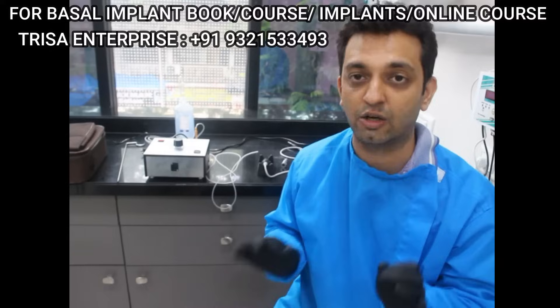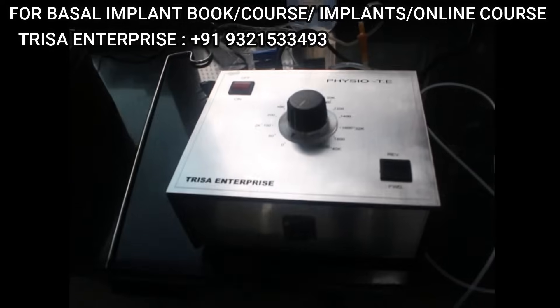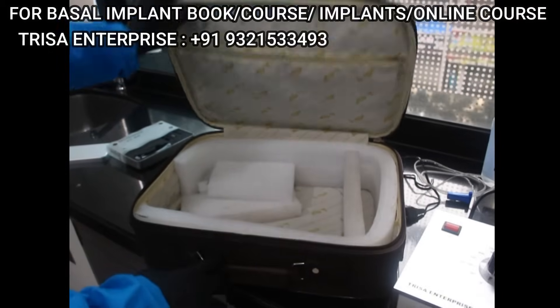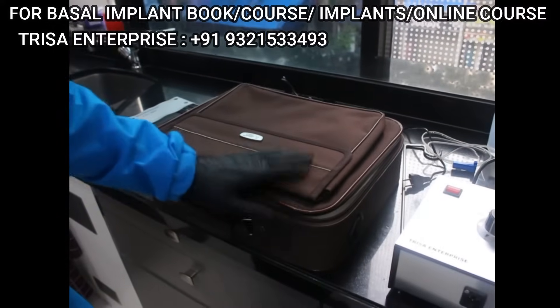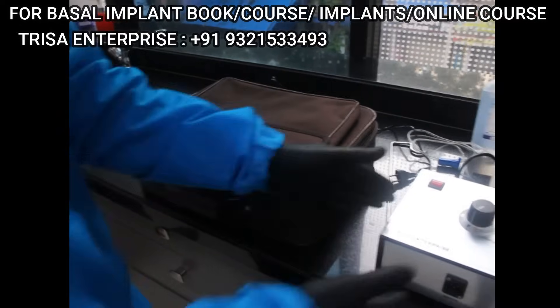Let me quickly show you the physio dispenser. This is the main control panel or box, which comes in this wonderful suitcase. All you consultants out there who want to carry it or store it nicely — you can put it back in this lovely suitcase, which we are giving complimentary with the physio dispenser.